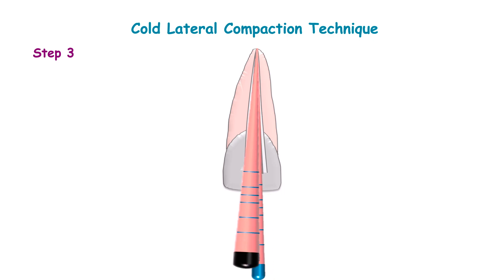Insert an auxiliary cone corresponding to the size of the spreader. Continue this process until the canal wall is filled with gutta-percha without any radicular pulp space. Make sure there is complete obturation in the canal without any visible voids.